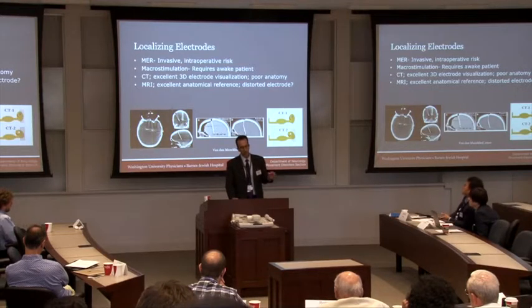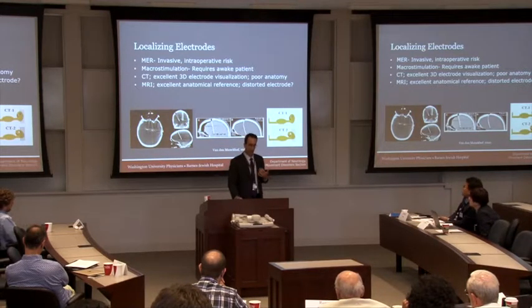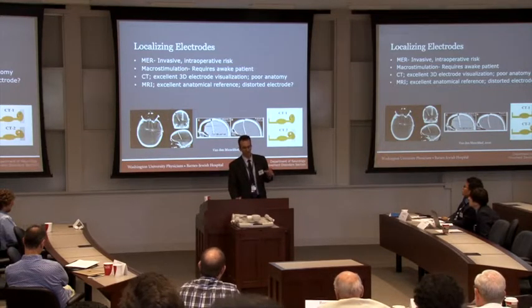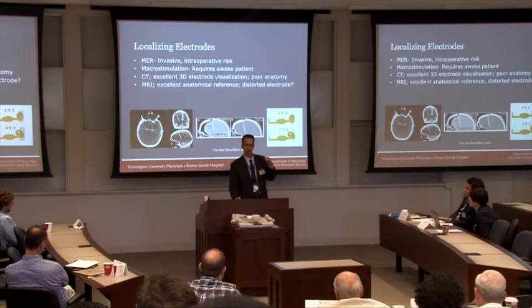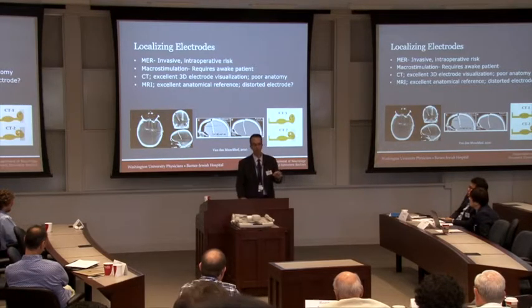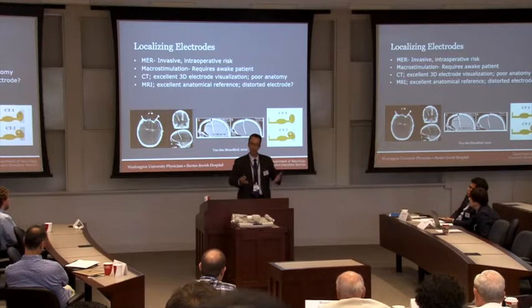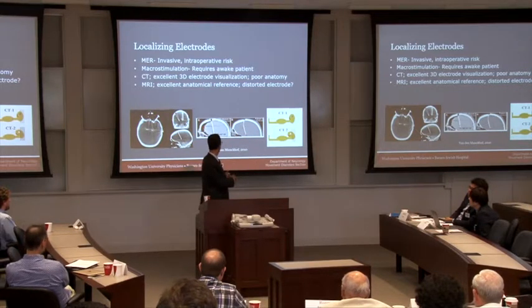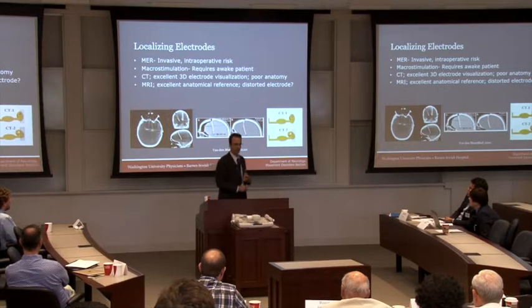We can do this in various ways, and in fact, that's why we, at academic institutions such as ourselves, perform microelectrode recording. Because when we perform DBS, after we obtain the preoperative imaging that I was showing you, we place a wire in someone's brain. When we do that, the brain deflates. There's CSF, fluids that surround the base, seep out. Air enters the brain. This is an extreme situation, but you can see this air, and then over time, that air resolves and the electrode actually shifts.